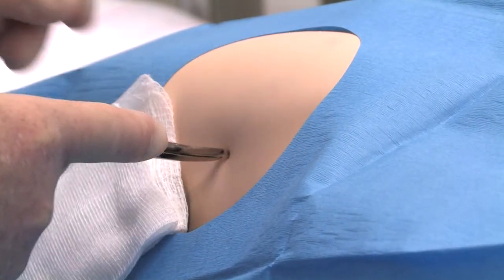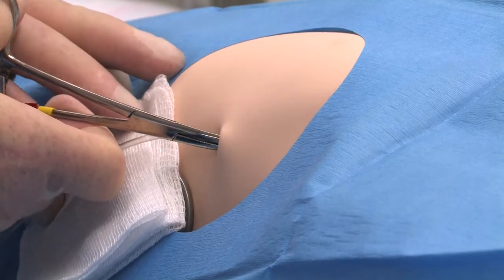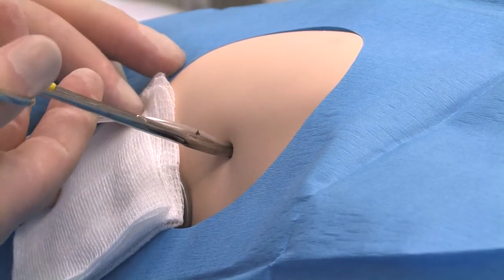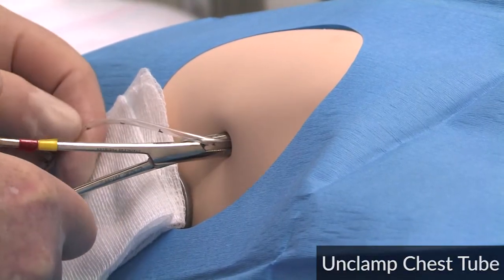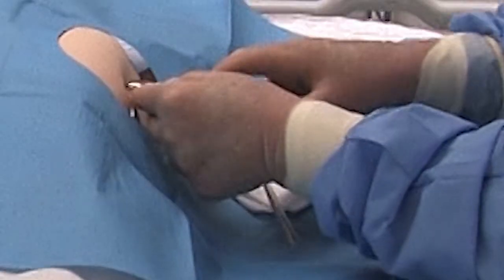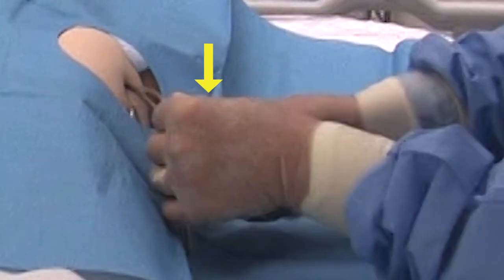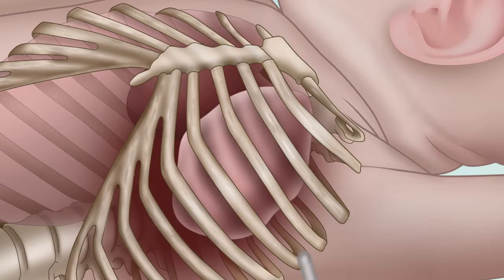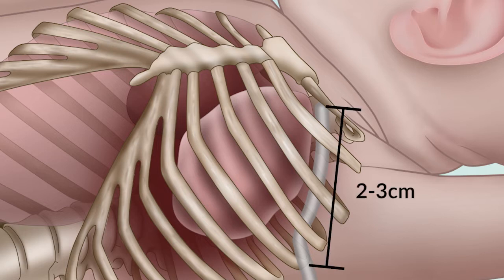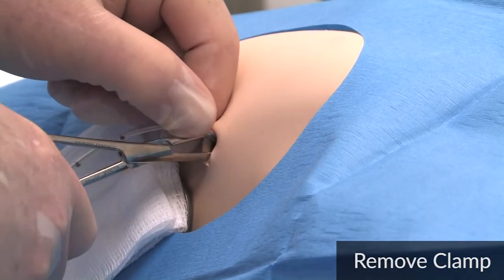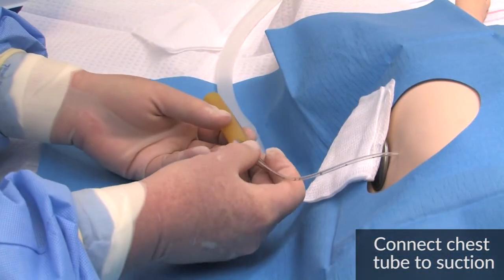Enter the previously made track and enter the pleural space. Once inside the space, turn the Kelly clamp 180 degrees. Unclamp the chest tube. To ensure the chest tube is directed anteriorly, drop your wrist while advancing the chest tube into the patient. Direct the tube anteriorly to the apex of the thorax, to the predetermined length, assuring all side holes are inside the chest. This distance is approximately 2 to 3 centimeters for infants less than 1500 grams, and approximately 3 to 4 centimeters for infants greater than or equal to 1500 grams. Remove the clamp, being sure not to dislodge the chest tube. Connect the chest tube to suction.